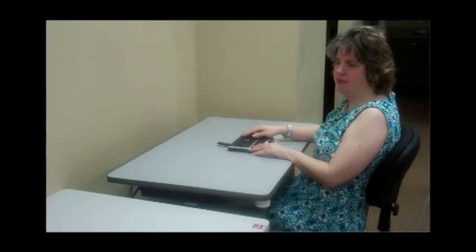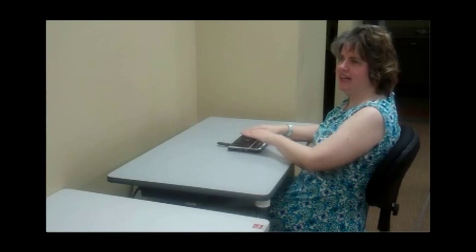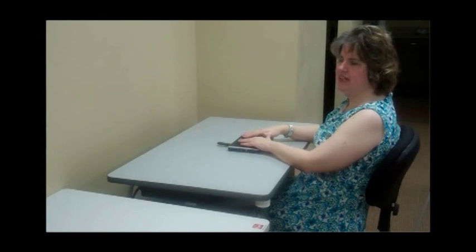File manager. The file manager is the equivalent of, in Windows, maybe like Windows Explorer. So you can use that to copy and move files and whatever you need to do, rename files, manipulate your files basically. Let me show you what some of this stuff does and how we get into the different things.